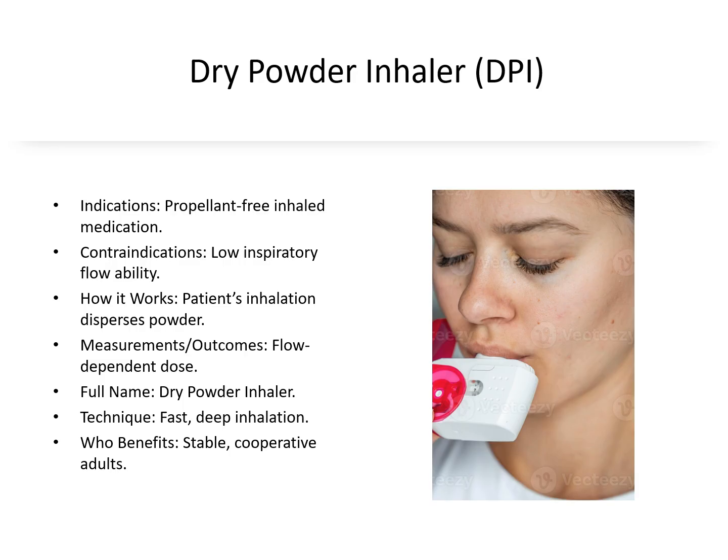The full name is dry powder inhaler. Technique is a fast, deep inhalation. Cooperative adult patients benefit the most.